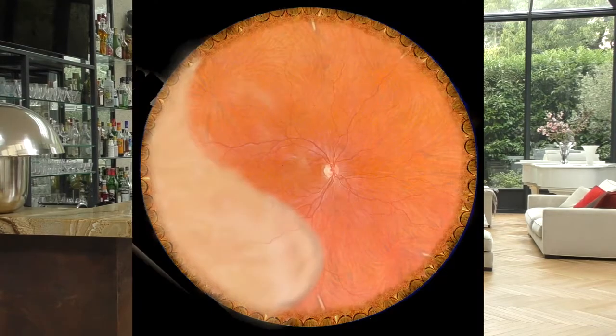Now let's see the lateral or inferior detachment, still on the right eye. If the detachment has an asymptotic connection line to the pars plana, this means that the tear at the origin of the detachment is located within 1 hour or 1 hour 30 above the highest connection point, and that the liquid passing through the tear detaches the retina under the effect of gravity.